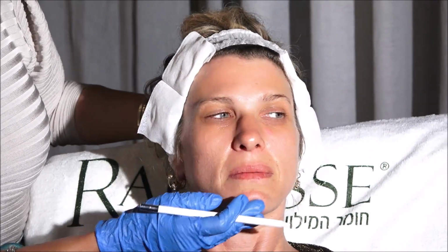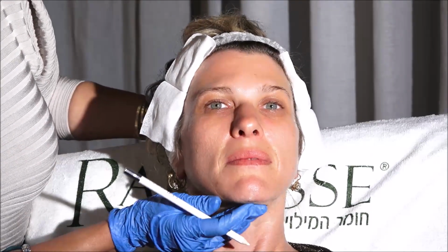This, you cannot correct with Radiesse alone, dilute only on the neck. This is a structural problem of the mandible, also in the chin. So I'm going to give structure to her jawline, not widening her face, enhancing the vertical vector. That means lower border and back angle. And I'm giving the lower projection of the chin that she's missing.